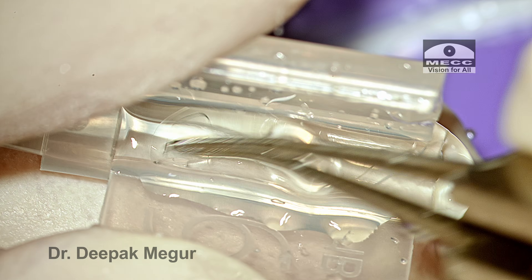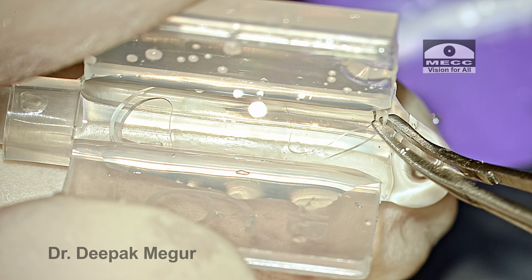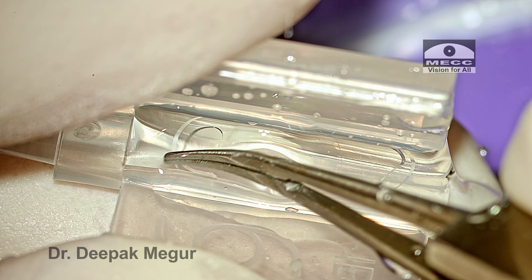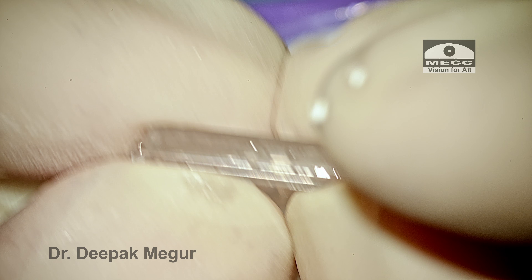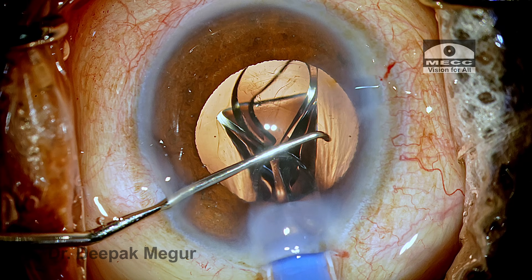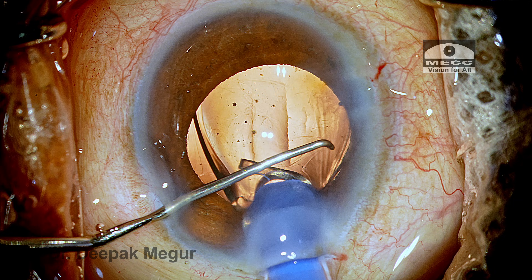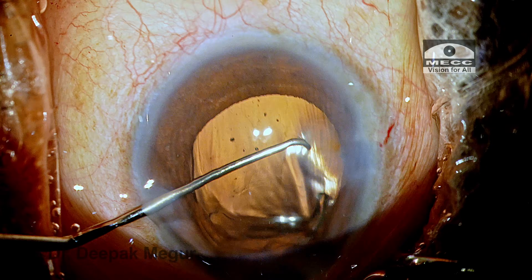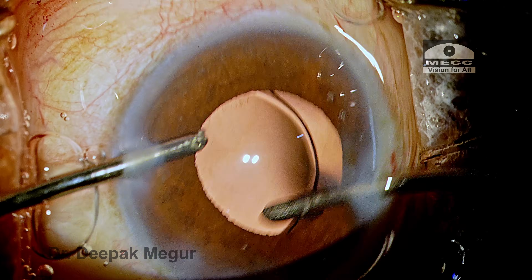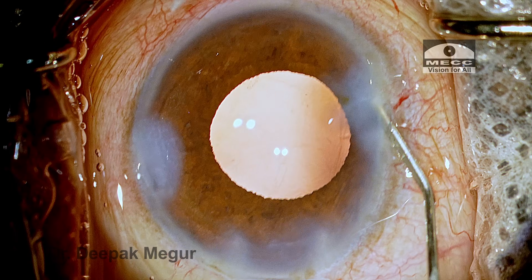The replacement lens is now ready and carefully loaded, then implanted. One of the more common reasons the trailing haptic gets torn is that the plunger overrides the trailing haptic — it gets stuck between the plunger and the floor of the cartridge and gets cut. So please ensure that while loading, the plunger is behind the haptic, not over it. The lens is maneuvered into the bag, OVD both in front and behind the lens is aspirated out, and the case is done.